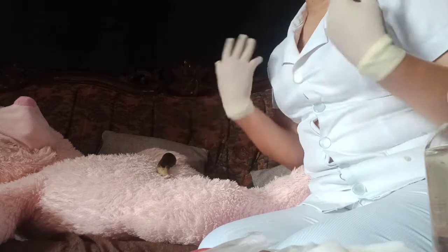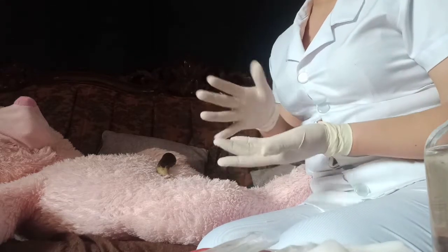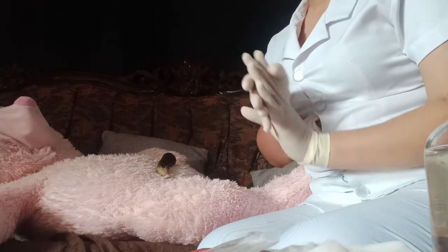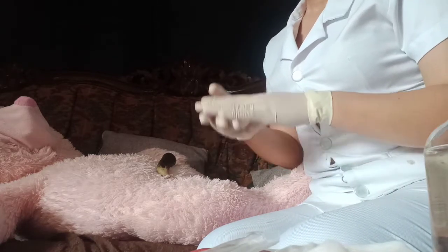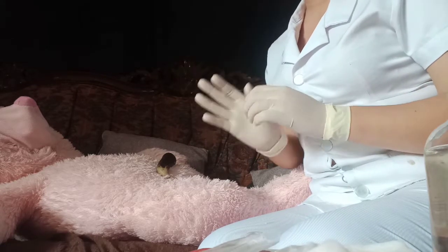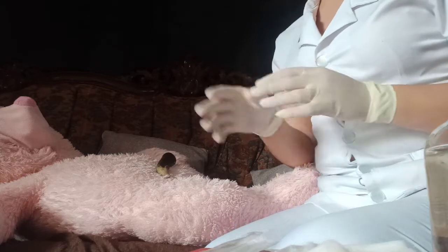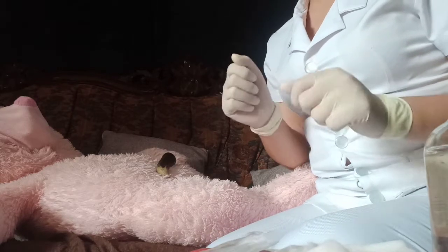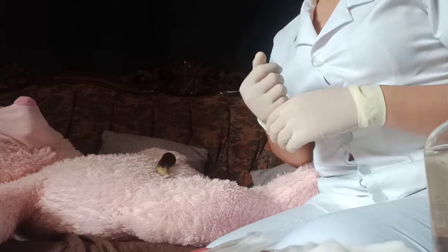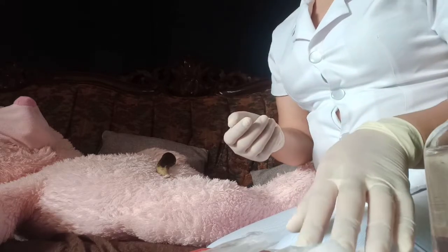So now we're going to apply clean gloves. I'm done applying clean gloves. Then, as agency protocol indicates, clean the site with an aseptic swab, starting at the center of the site and cleaning in a widening circle of 5 cm. Now we're going to place and hold the swab between the third and fourth finger of the non-dominant hand, or position the swab on the client's skin above the intended site.